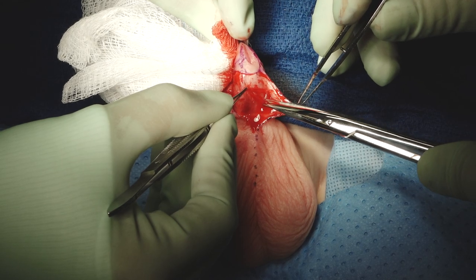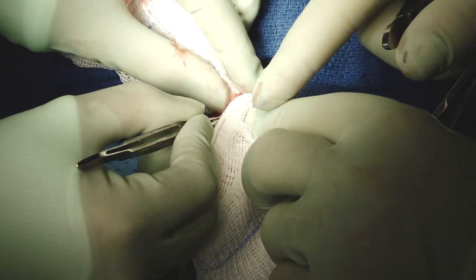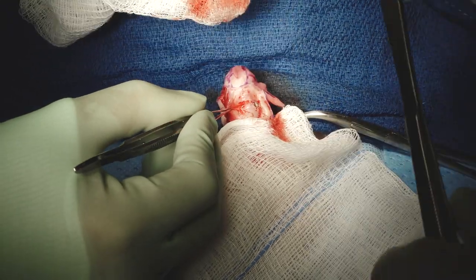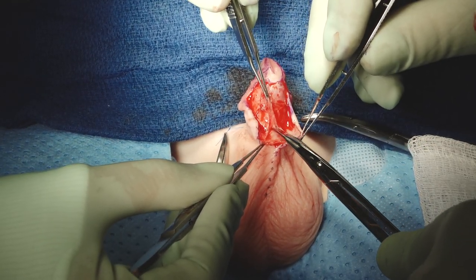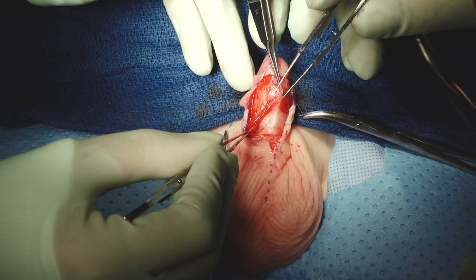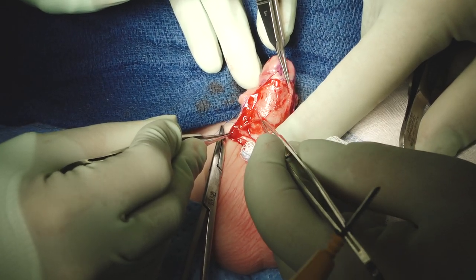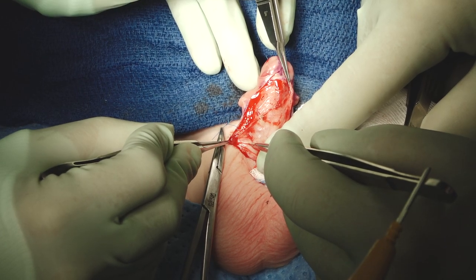We have been surprised — many boys who do have 30 degrees or more curvature have tells, signs preoperatively that warn you, but not always. When you examine and put your fingers at the penis-scrotal junction and see significant bending, you should be worried. Other signs are the humps, where the corners of the prepuce are — typically out distally like in this patient. If you see those humps more proximally along the mid-shaft, you should be very suspicious that even though it's a distal meatus, that's a form of proximal hypospadias and that patient likely needs a staged repair.